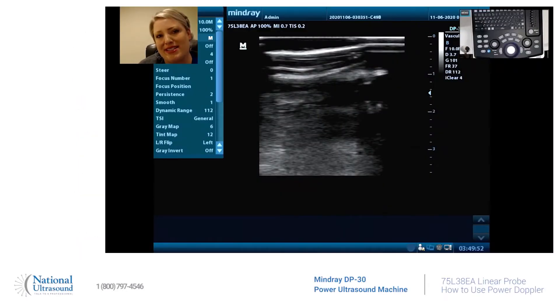Hey ultrasound gurus, this is Holly. I am a registered cardiovascular and general sonographer since 2008. I am here at National Ultrasound using the Mindray DP30, and I am going to show you how to use pulse wave Doppler on the Mindray DP30.